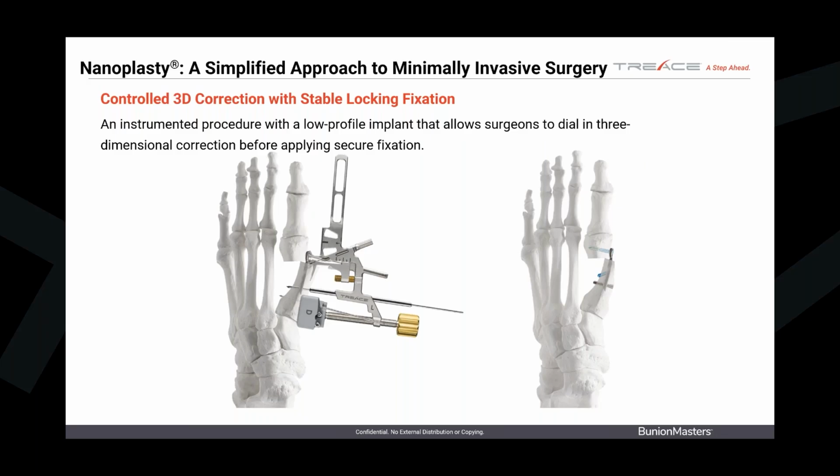One thing I do want to define right now, and there'll be a lot of discussion about this in the future, but intramedullary plates are minimally invasive surgery. Don't let anyone tell you they're not. The percutaneous surgeons in your neighborhood will be like, well, that's not MIS. It is. The definition of minimally invasive surgery is a surgery done in the smallest amount of incision possible to get it done. This is the smallest incision needed, 1.5 centimeters, to get this plate in and insert these screws. It's not percutaneous, but it is minimally invasive. So you can adequately advertise this to your patients and it will be accepted.